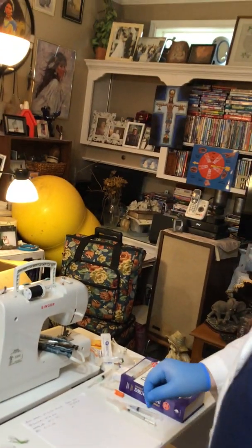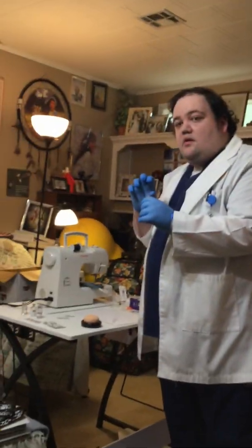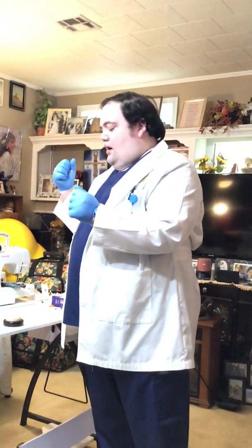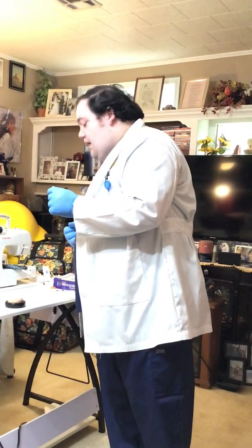So we've given him a shot. Now, what you're going to want to do is pull the plunger back before you inject it to make sure there's no blood. If this had been a live person, we would have done that. If you get blood, then you're in a vein, and we don't want to put this drug into the vein. We want to put it into the muscle.